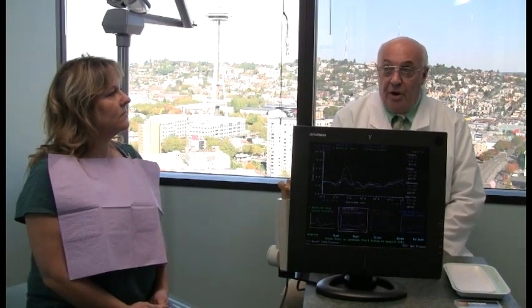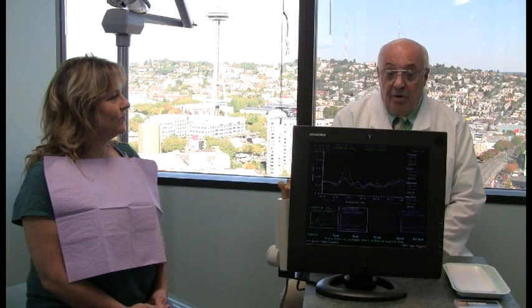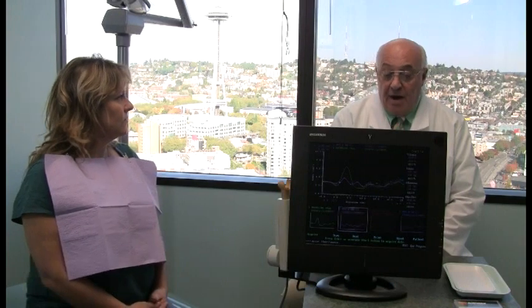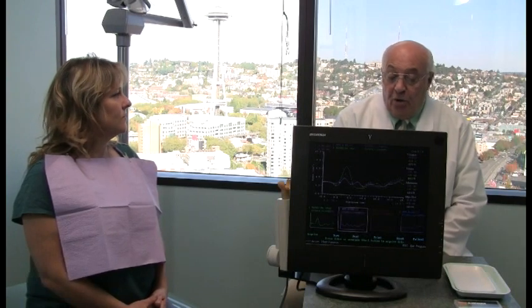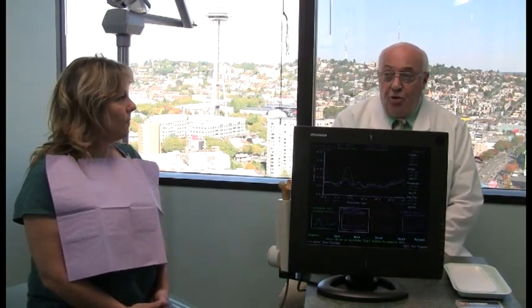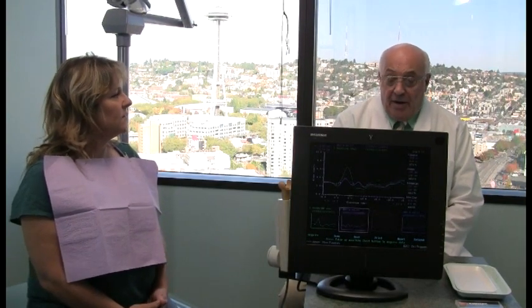And then we went to a simulator that positioned her at 2 and 8 vertical, and she rated that as a 5+, as well as being extremely comfortable. And then we went to a 3-8, and she liked that, and that was also comfortable. And finally we tested with end-to-end 8, and that was not only a 5, but it was extremely comfortable. So what we have selected are 3 mandibular position simulators that we're going to use here in a couple of moments to run through those and see what we get from the data standpoint.